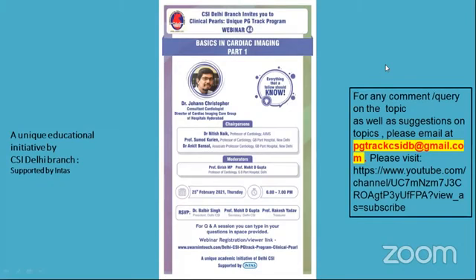If you have a volume of that and your business guy says, sir, shall I get a PET MR? It is sarcoid. Sarcoid is the disease in cardiology wherein the PET MR will truly keep your business development guys happy, because it is a classic disease which has a varying composition of inflammation and scar in different proportions. The PET does a great job for inflammatory evaluation by the FDG, and the MR does a great job in scar evaluation. So your turnaround time is very fast.